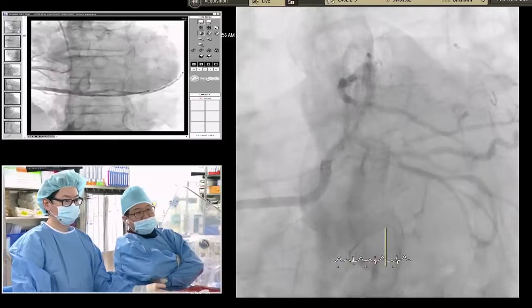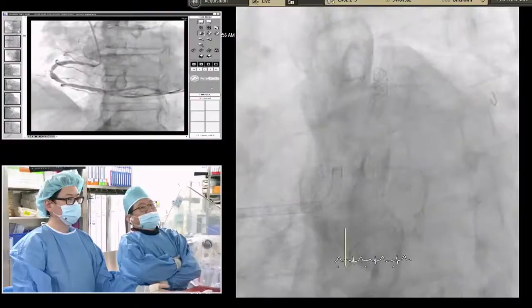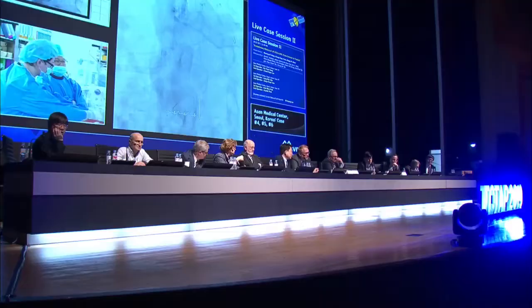Dominant RCA. RCA itself looks fine and largely distributed. So when you fix the left coronary artery, the significance of the circ is lesser because the territory of myocardium supplied by the right coronary artery is a huge one. That's why I suspect, exactly what you said, that if you did FFR the circ, it would be negative, even though it's obviously severely diffusely diseased. I don't know that, though, because it goes all the way up to the ostium. There's diffuse disease.